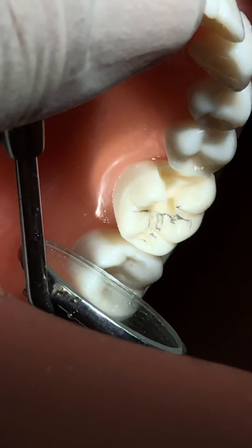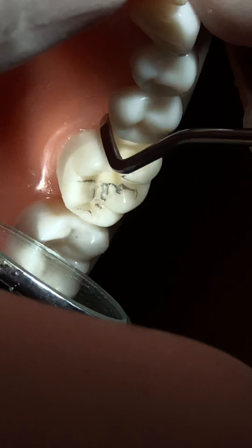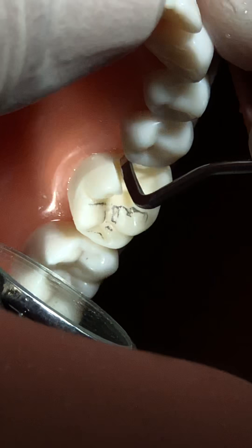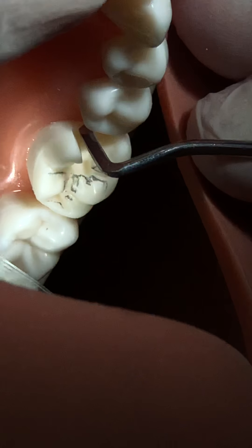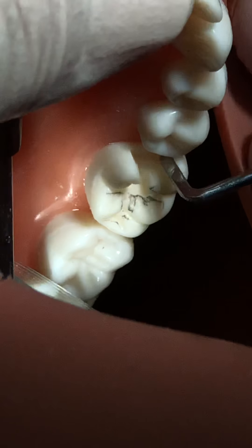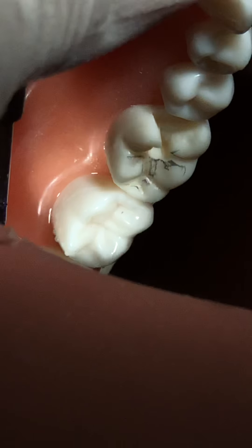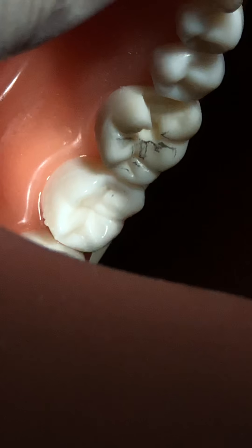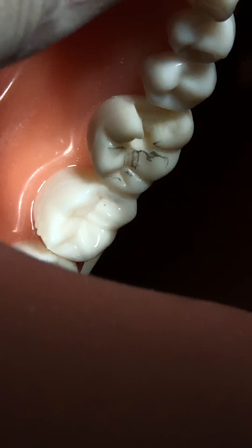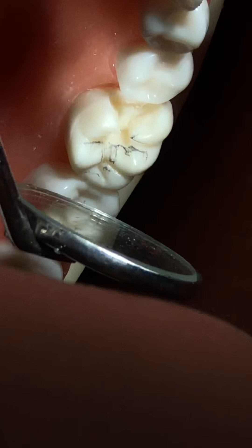You can use a gingival margin trimmer to make a bevel on the gingival floor. You place it on the edge of the gingival floor and rub it with one or two strokes - that is enough. If you use three, four, or more strokes it will create a bigger bevel, which is not recommended. A small bevel is sufficient just to keep the direction of the enamel rods steady.